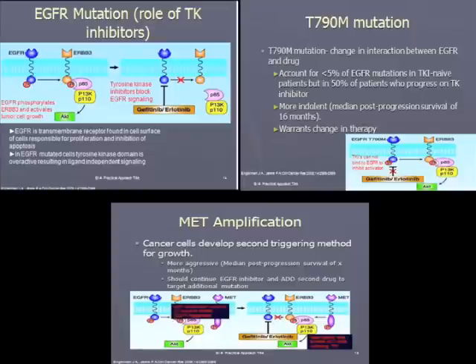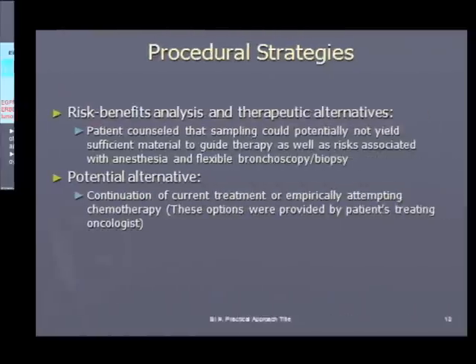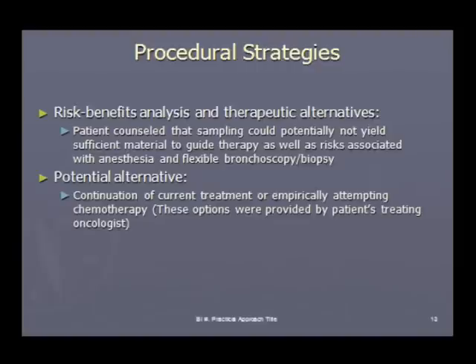In each of the exercises, attention is focused on unique components of the procedure-related consultation. In this section, the risks and benefits as well as potential alternatives are discussed. In this case, they are only briefly reviewed, but the importance of these steps should not be minimized.